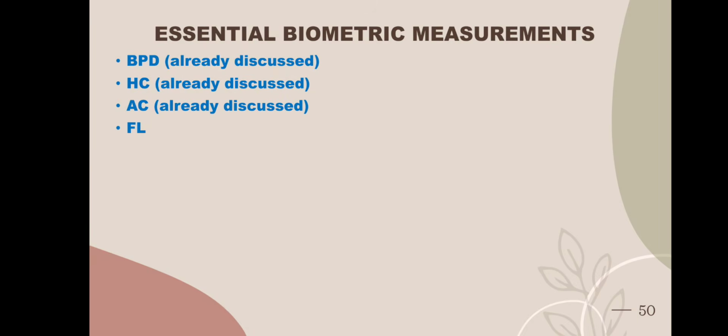The essential biometric measurements: BPD, HC, AC and FL. The first 3 are already discussed. Now we shall discuss the remaining parts.